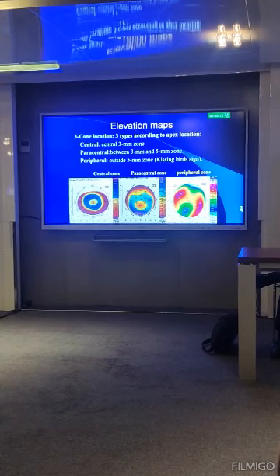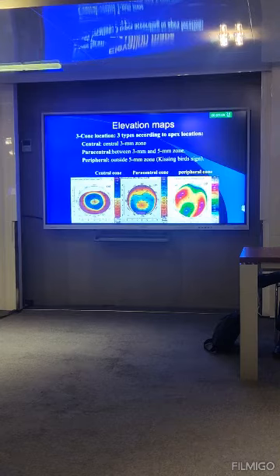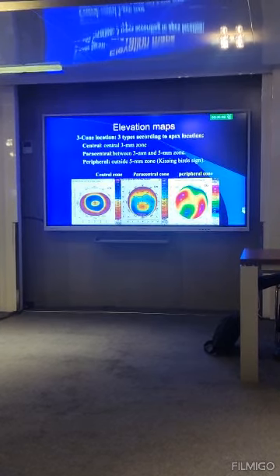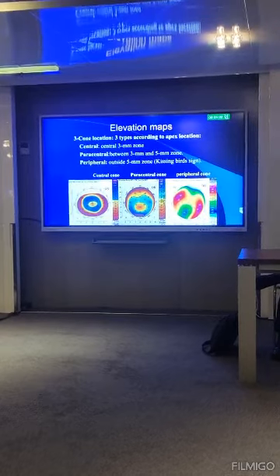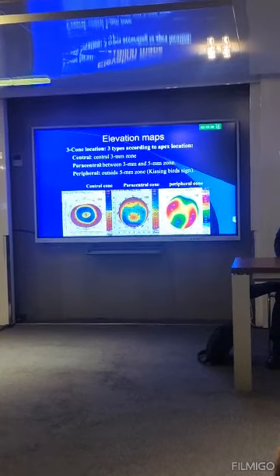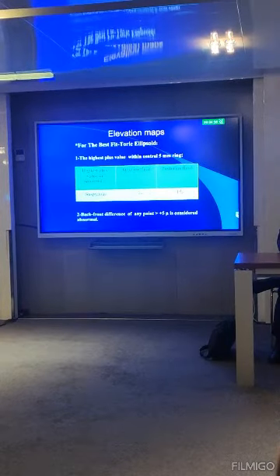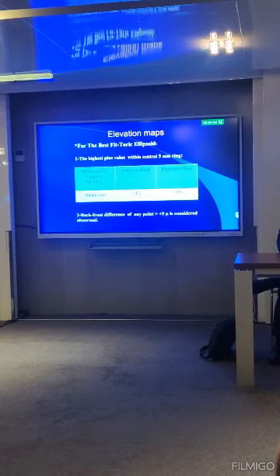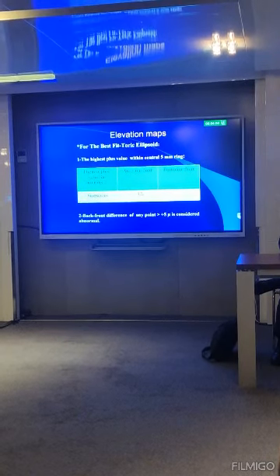The cone location we can determine from this sphere: a central cone is within the 3 mm zone, a paracentral cone between the 3 and 5 mm zone, and a peripheral cone outside the 5 mm zone. The kissing bird sign is usually seen in pellucid marginal degeneration and pellucid-like keratoconus. The best fit ellipsoid gives a more accurate determination of cases of keratoconus.